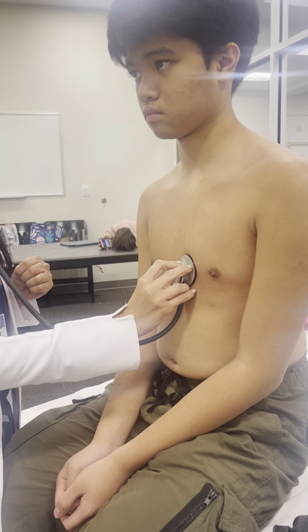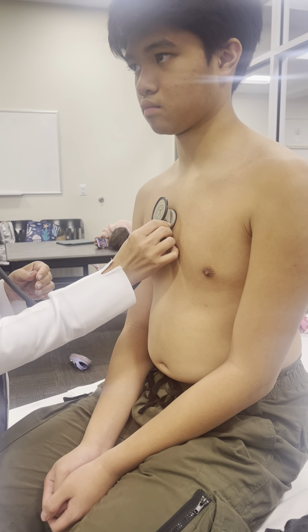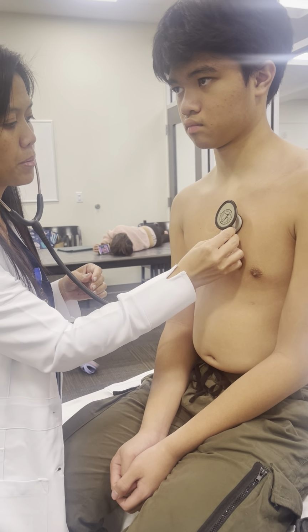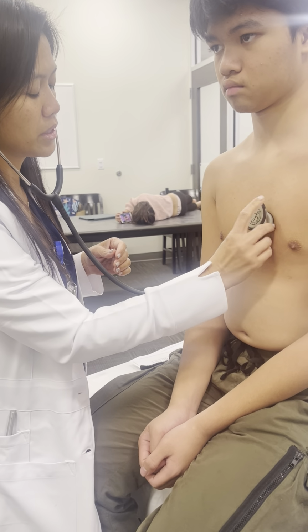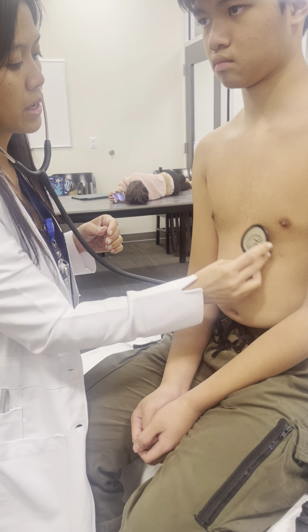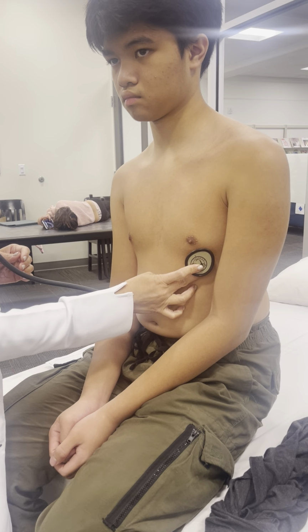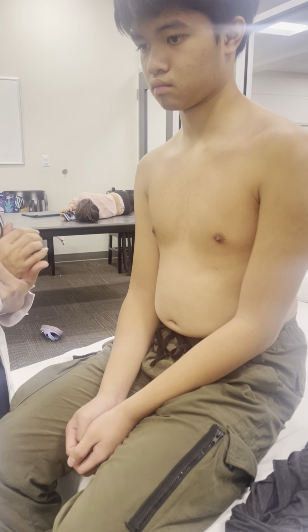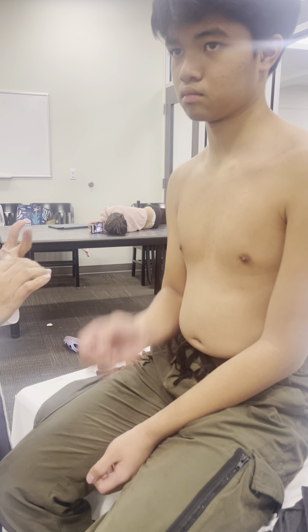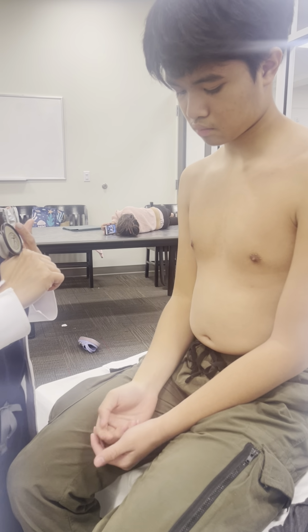So usually you can listen with both the bell and the diaphragm. Again, the aortic, pulmonic, the Erb's point, then tricuspid, and then the mitral. So when you're listening for murmurs, you're listening for a normal S1, S2, and any extra sounds like S3, S4, or split S2s.